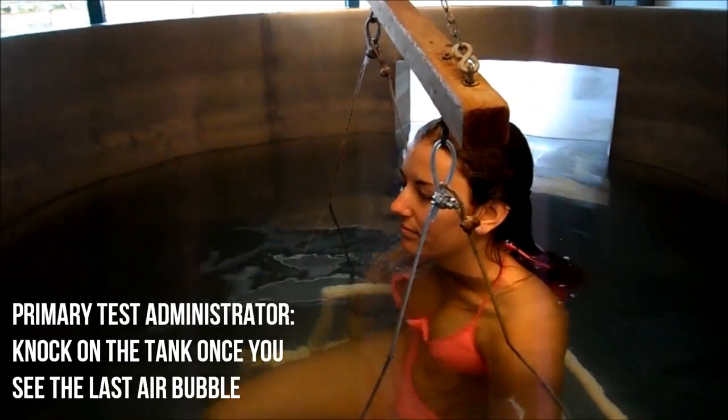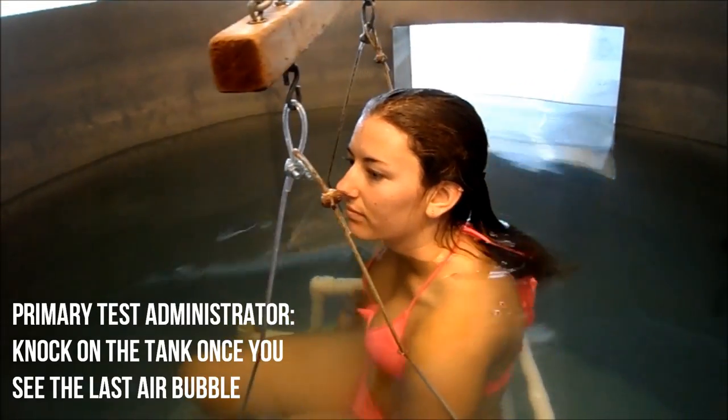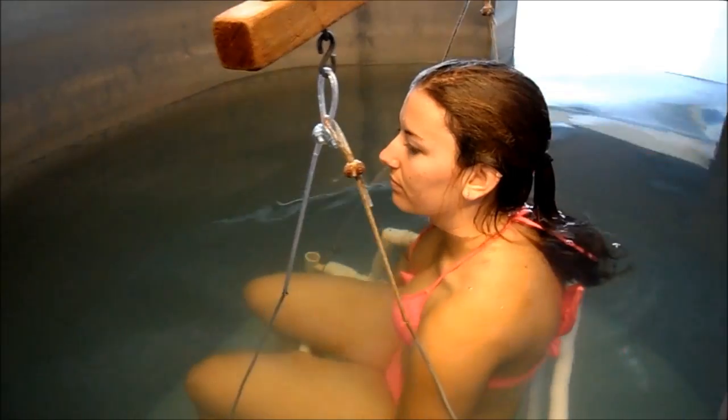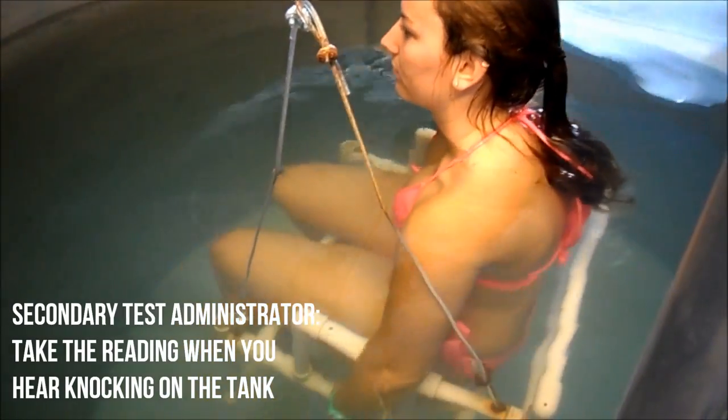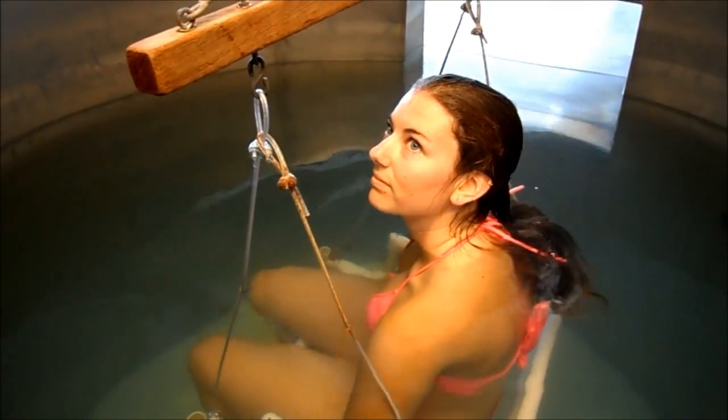Once you see the last bubbles come up, knock on the tank. This signifies that they can come up and breathe again, and also that the secondary test administrators can take a reading on the computer. Tell your client that if they ever feel like they need to come up for air for any reason, just to come up and we can always do the test again.